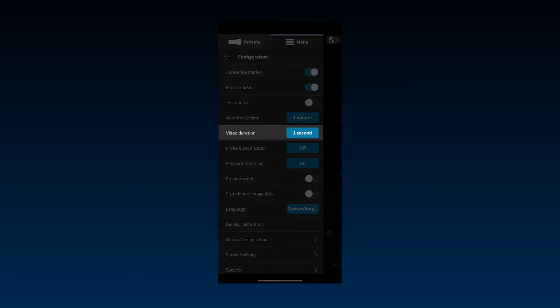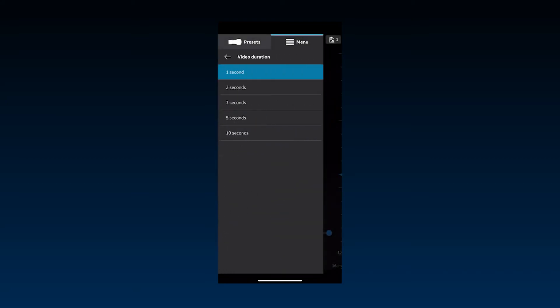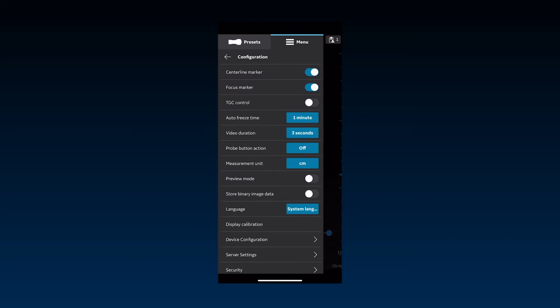Video duration can be used to determine the number of seconds available after freezing the image. It can be set to 1, 2, 3, 5, or 10 seconds depending on documentation needs. That is also the length of the loop if stored.